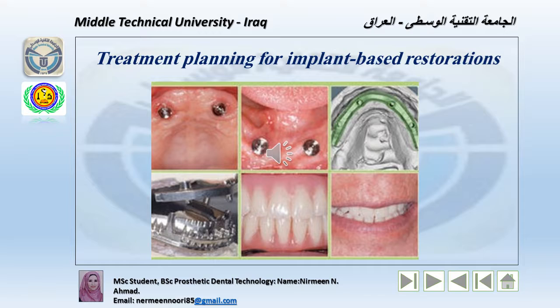First, a diagnostic wax-up of the proposed tooth form and ideal location must be achieved. From this, a radiographic guide is fabricated that simulates the wax-up. Next, diagnostic imaging must be done in order to determine the alveolar bone available for the implant placement. It becomes possible to obtain a three-dimensional digital image. This is an accurate assessment of the height and width of the alveolar bone available for the implant placement.